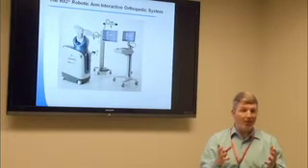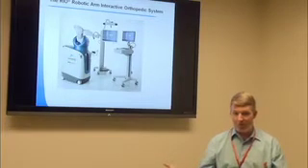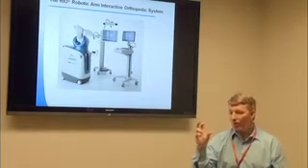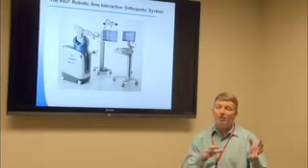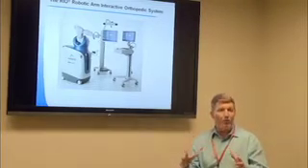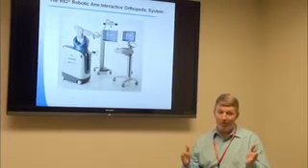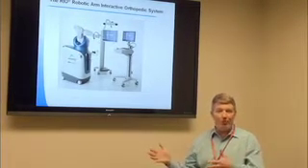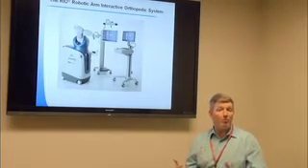So that basically means that instead of just tossing a dice or tossing a coin and getting it right 50% of the time, we're getting it right almost 100% of the time, based on what your anatomy shows us on the CT scan. So it's increased our accuracy with how well we do these surgeries. I always tell my patients, this is not a surgery we've been doing that's new. We've been doing the surgery for a long time. This technology just allows us to do the surgery better.